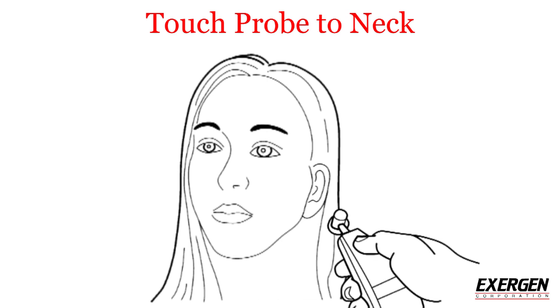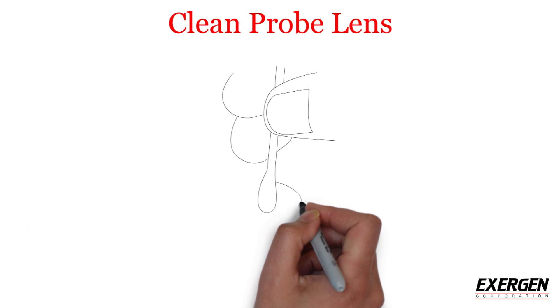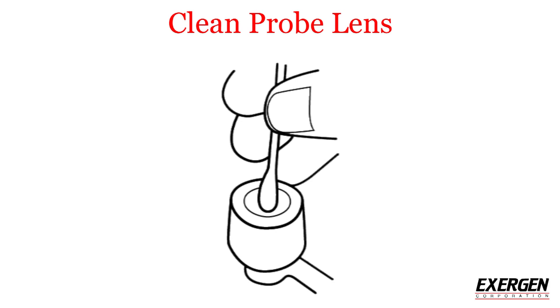With the button still pressed down, lift the probe from the forehead and touch the neck just behind the earlobe. Then lift the scanner off the neck and stop pressing the button. Read and record the temperature. To get consistently accurate temperatures, make sure to clean the probe lens every two weeks.